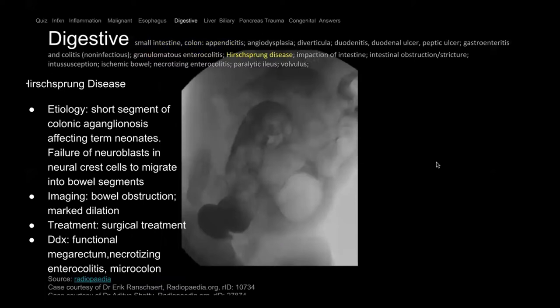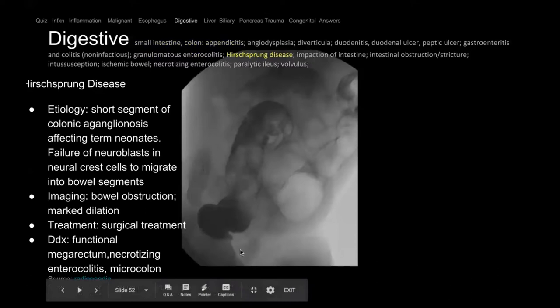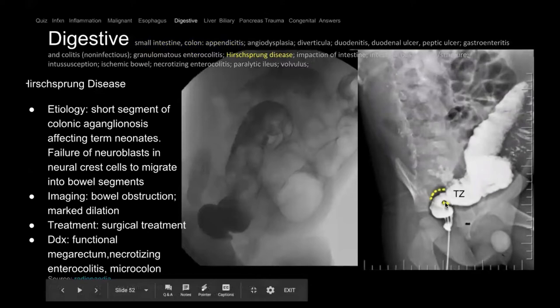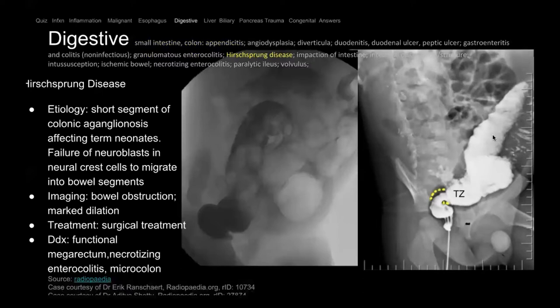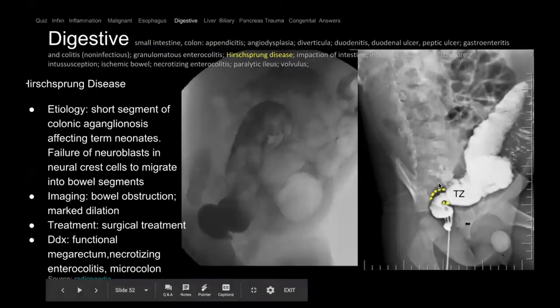Hirschsprung disease involves absent ganglion cells — the normal nerves are not there. Patients get megacolon because the affected segment doesn't open up due to absent nerve supply. On this barium enema — contrast through the rectum into the colon — the rectum is very small relative to the sigmoid colon. That's how you diagnose Hirschsprung. Young children are affected and require surgical correction because of problems defecating.